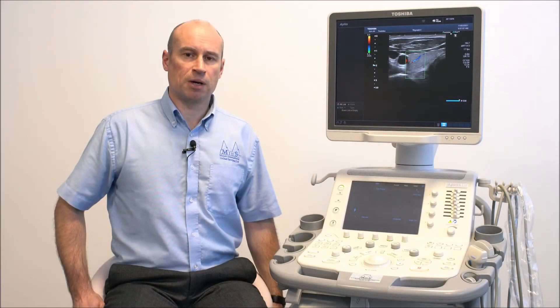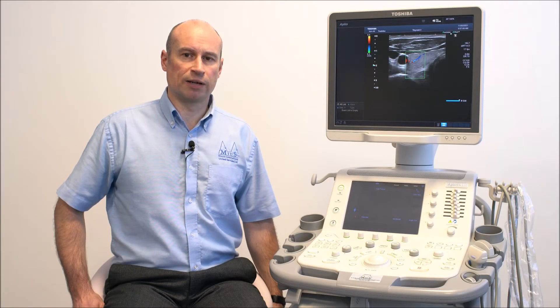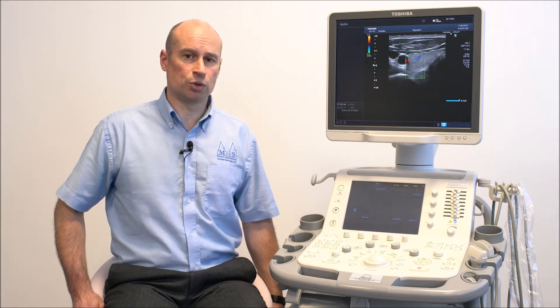If your veterinary practice is in the market for a general-purpose ultrasound scanner, the Toshiba Aplio 400 and 500 series could be the ideal choice for you.